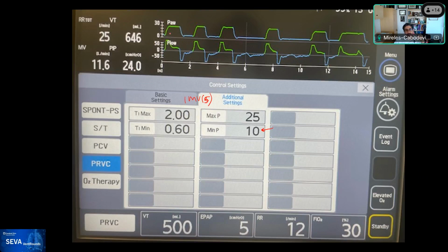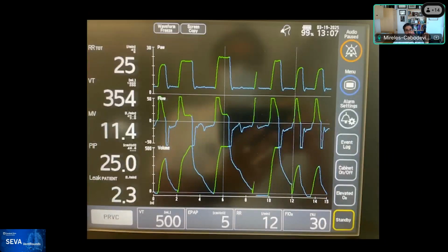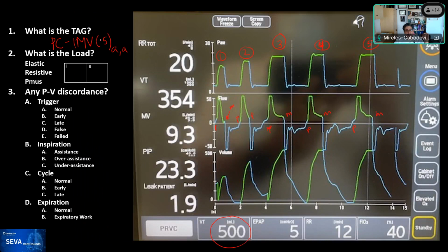And you can see that every breath is now being cycled by the patient, and every single one of them has different inspiratory times. You can see that here it was a very long one. That means that the mandatory breaths have been suppressed. I'm sorry, this is the only breath sequence that I have to show you that shows that, but that converts this mode essentially into an IMV type 2 type of mode.